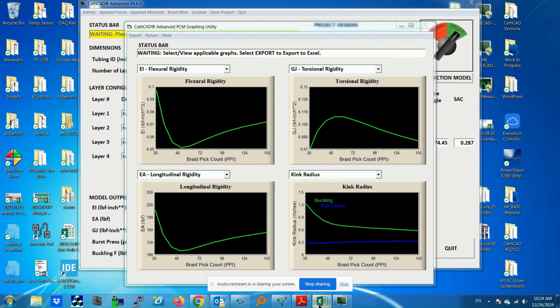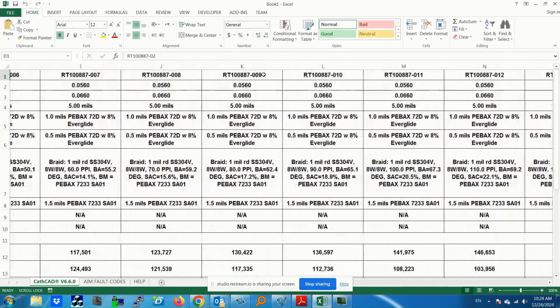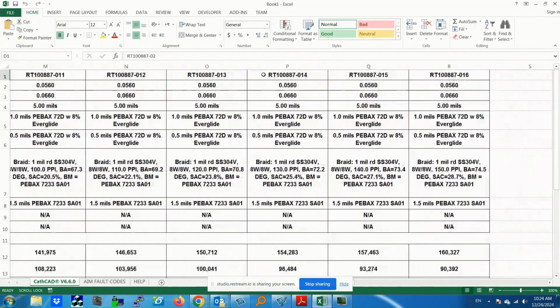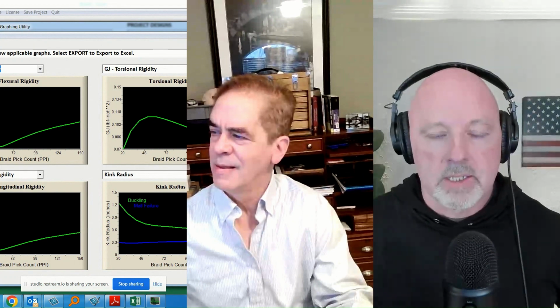Interesting. Just very quickly, you want to see the Excel. So again, we had 2 models before, and now here's all our models, all stored for the user. So again, we've saved the user a lot of time not having to write things down. Yeah. Wow.